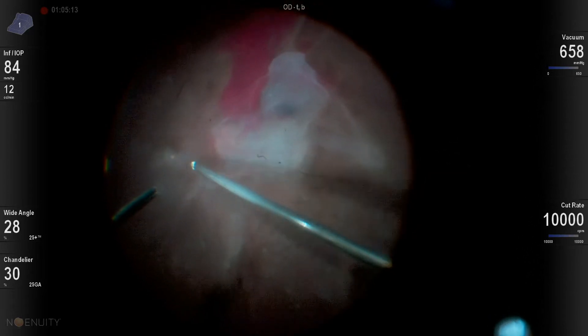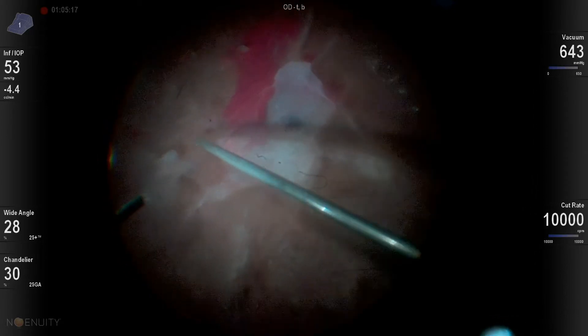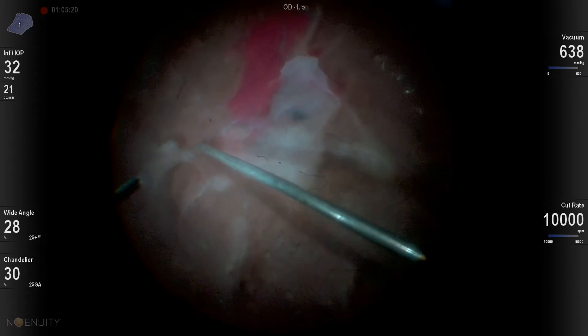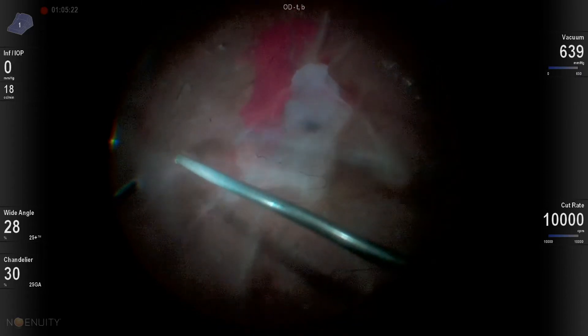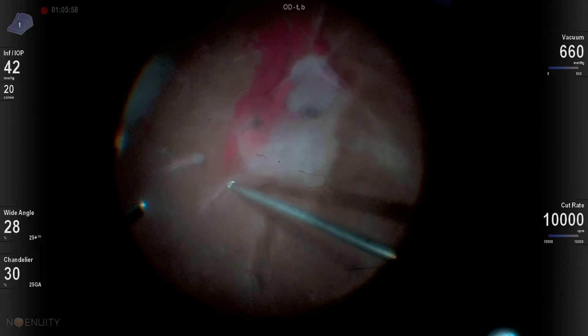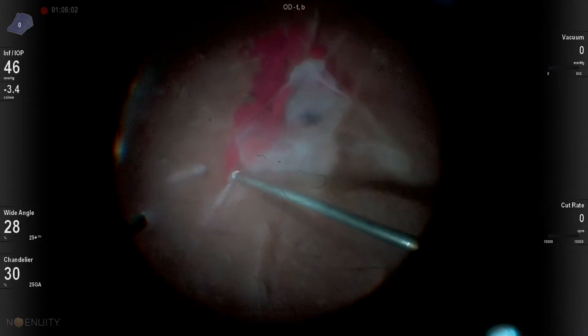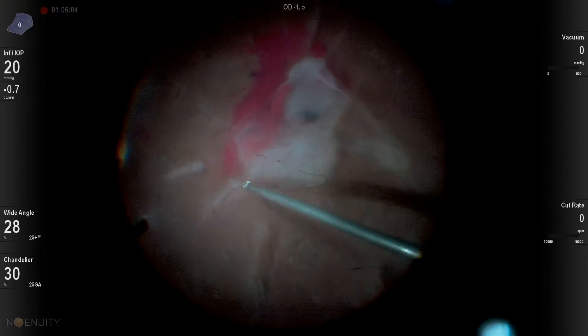It's amazing how much this 25-gauge, 10,000-cut-per-minute beveled cutter can actually do on its own. I'm simply applying aspiration and cut over these areas of vitreous traction, and anything that's lifted up really gets eaten away by the cutter without any damage to the underlying retina.